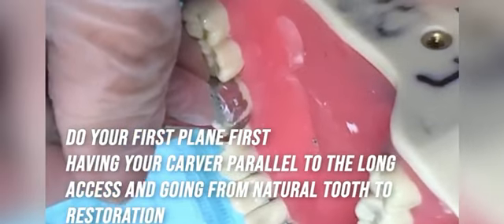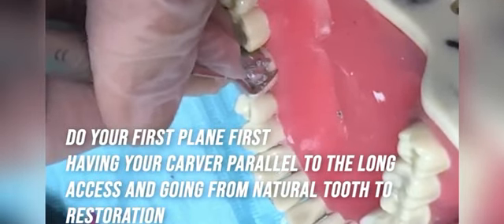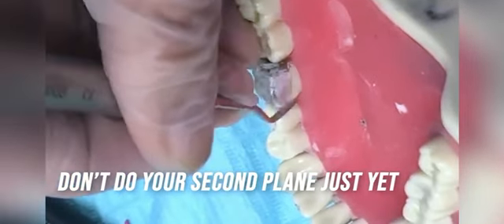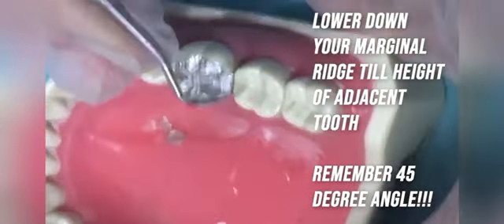Now we are doing the carving on the lingual part. We are keeping half of the instrument on the tooth surface and half on the restoration, so we will not get any ditch. The first plane will be parallel to the tooth surface. While we are doing the cusp part, we can keep it at an angulated position.